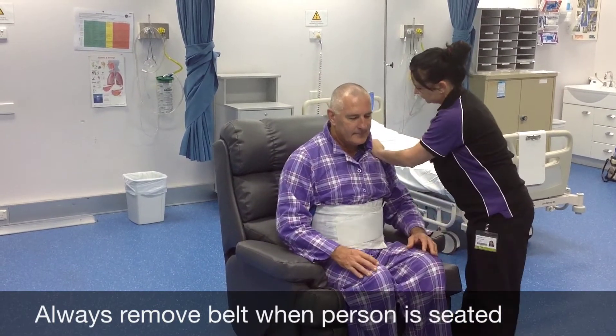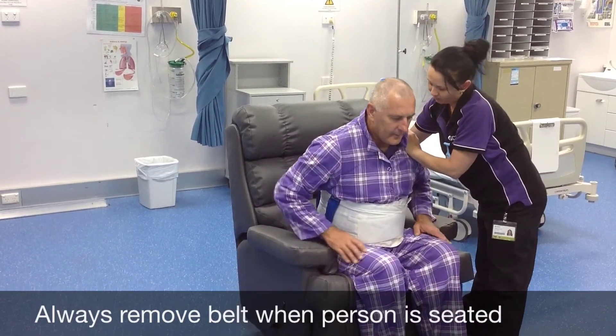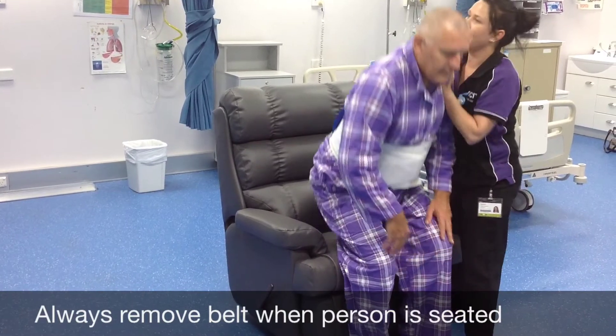Always put it on while the client is sitting down, then do the standing transfer. Remember the three big rocks — and Chantel could have rocked a little bit harder there.